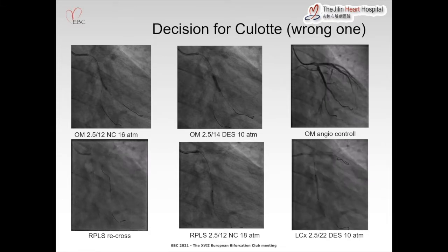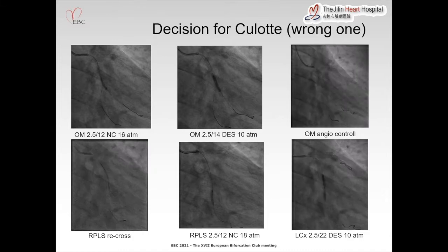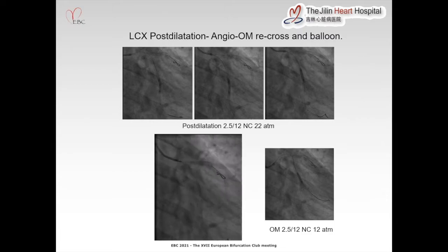They pre-dilated the posterolateral and immediately implanted a stent on the circumflex posterolateral. Then post-dilated only with the balloon used to pre-dilate, extensively, with quite a good result up to this time.